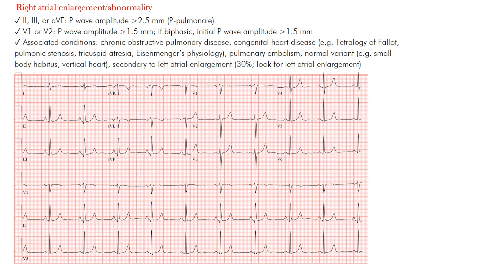First we're going to look at right atrial enlargement or abnormality. This is a finding associated with many conditions, and what we want to do is be able to recognize it on the EKG. You want to focus on a few leads — the leads we focus on when looking for atrial abnormalities are mainly lead 2 and V1.